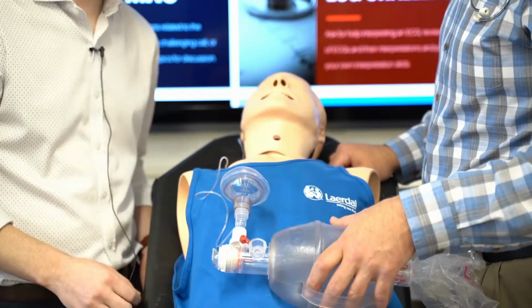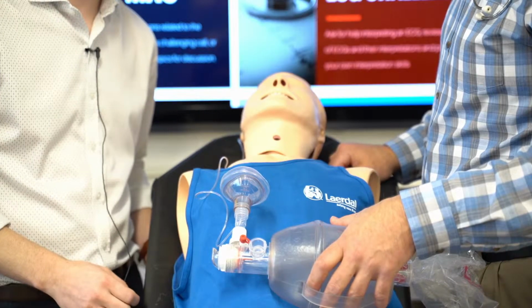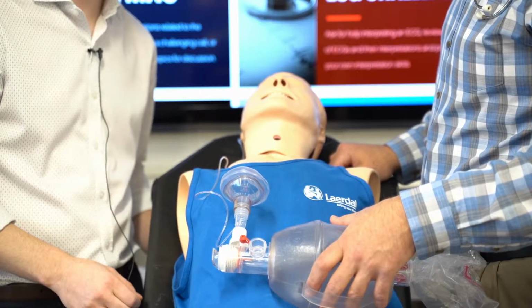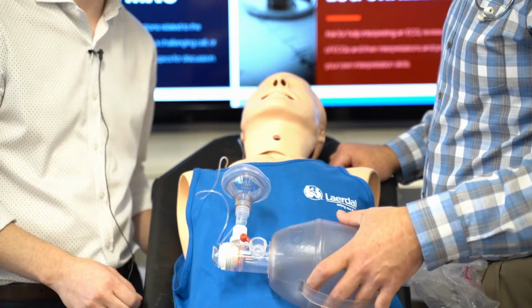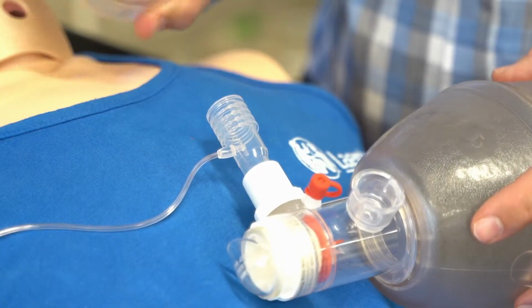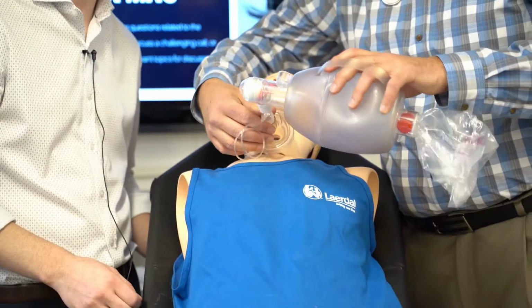With the well-established laryngectomy patient, or even the tracheostomy patient that doesn't have a tube in place, we're going to go ahead and try to ventilate via the stoma itself. Now to do so, we're going to put a pediatric mask on an adult BVM, and we highly recommend the use of end-tidal to try to judge the quality of your seal.